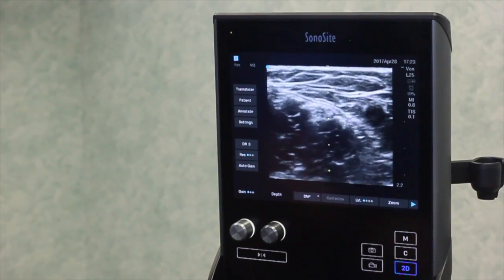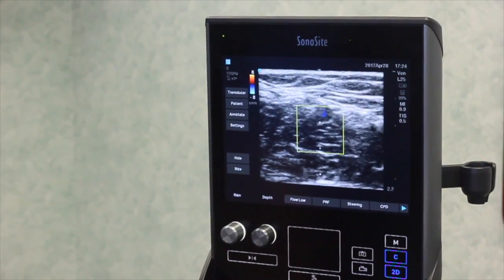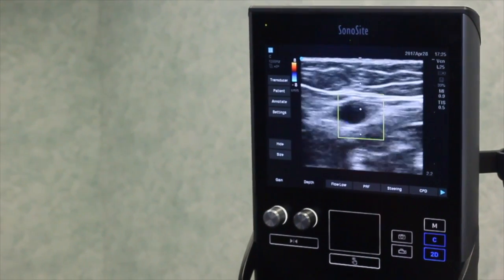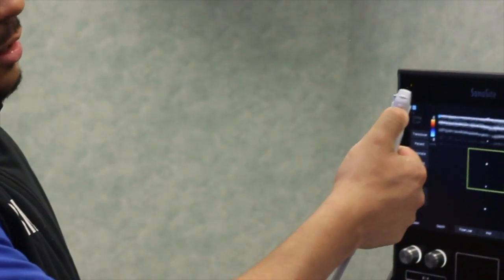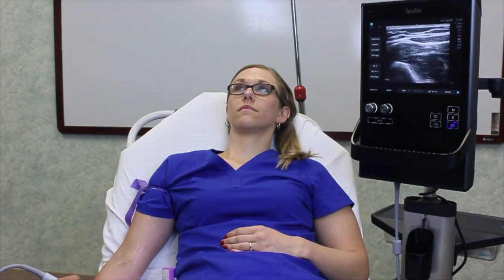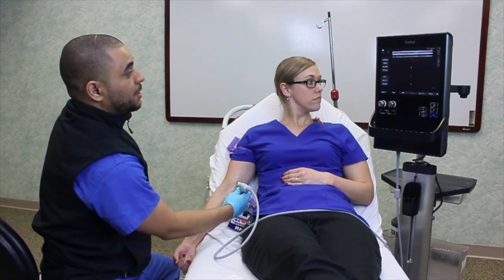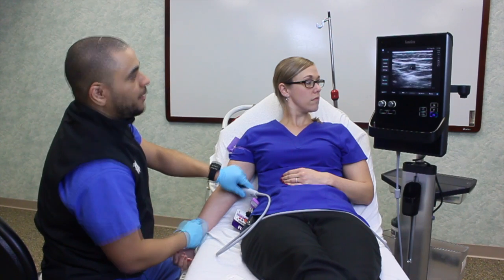The machine has a color feature — activate it by hitting 'C' for color — which generates a pulsating screen to help identify flow. Moving over to the basilic vein, when you compress it you can see a constant flow of blue. It's also important to understand that the dot on the screen correlates with the dot on your probe and should be on the same side as your machine. As always, start at the bottom — but for teaching purposes we're demonstrating here. Once you find your desired vessel, position the machine to maximize your success with IV starts.